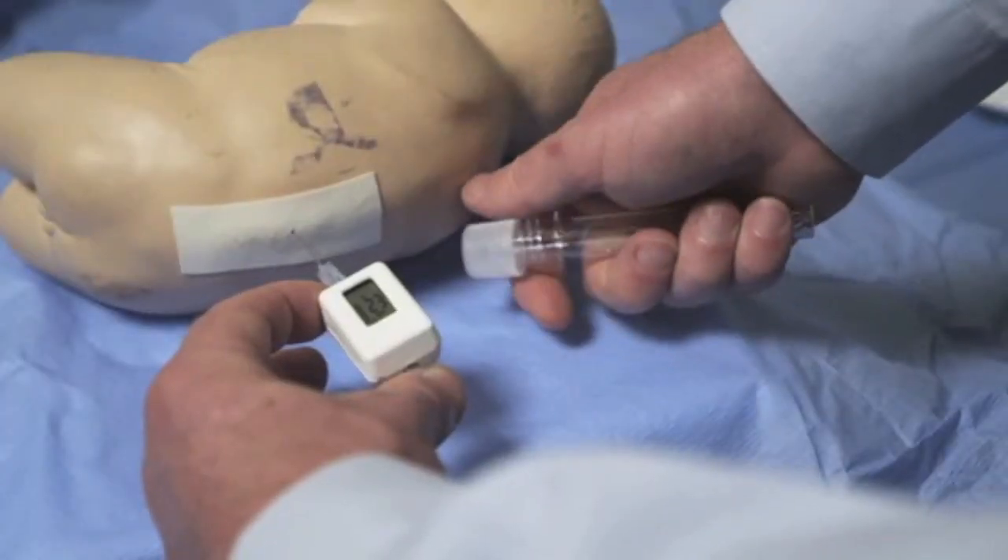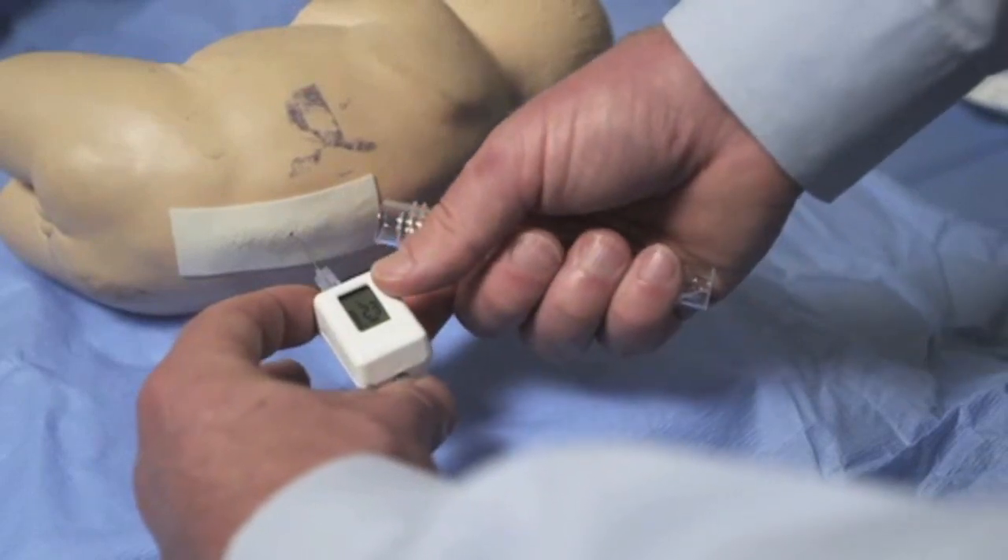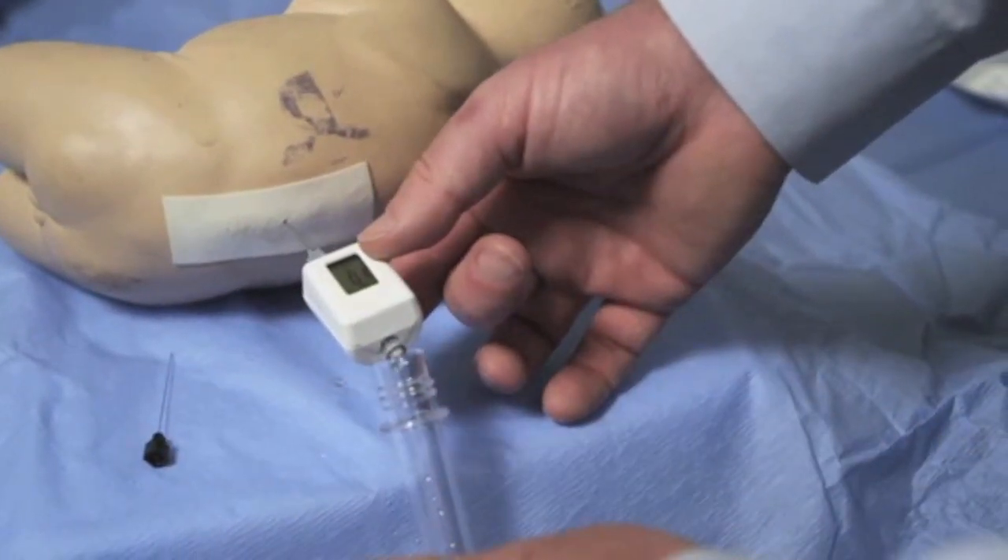Once the opening pressure is obtained, the rear of the device can be uncovered, allowing collection of CSF.